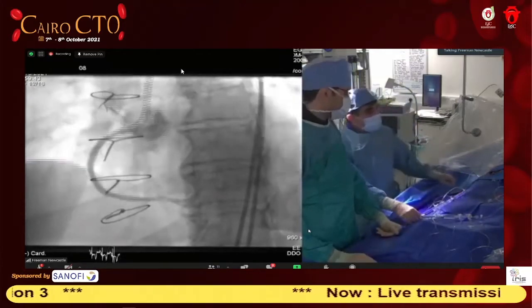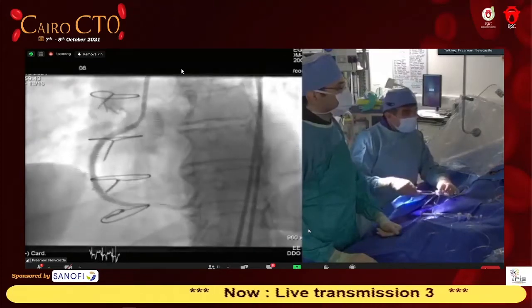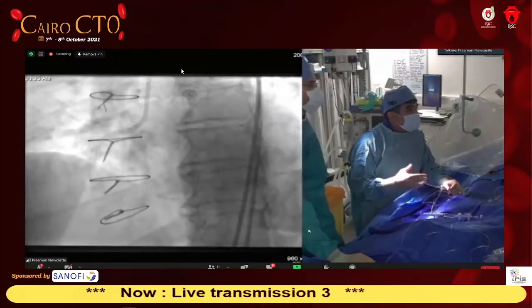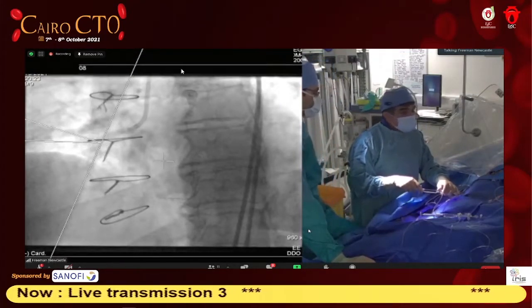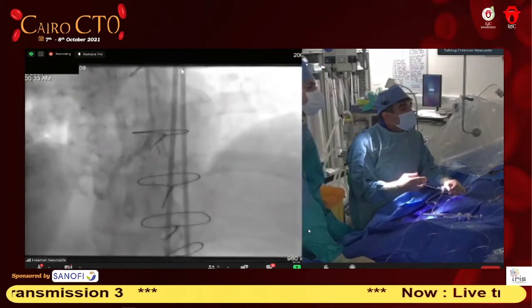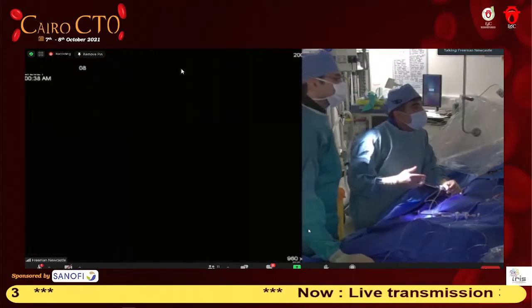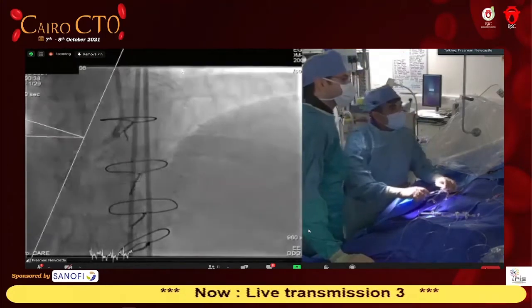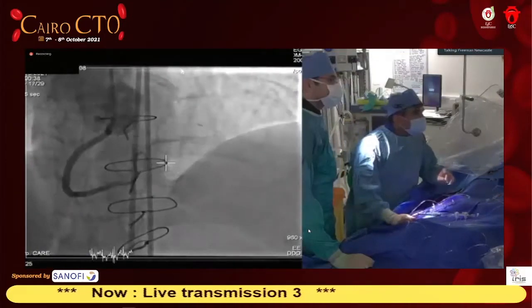Also, what could be the reason for this is the blood running from the vein graft, because the vein graft is still patent, remember? So maybe that's a distal part. Go to cranial view for me, PA cranial. And that sometimes could be the reason. And this is why often the argument happens. We know this because the native arteries block off and lock after vein graft because of the stagnation. Here you go. See the competitive flow distally? Yeah. But we do have a dissection here.